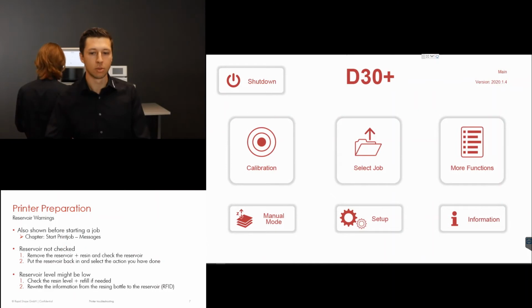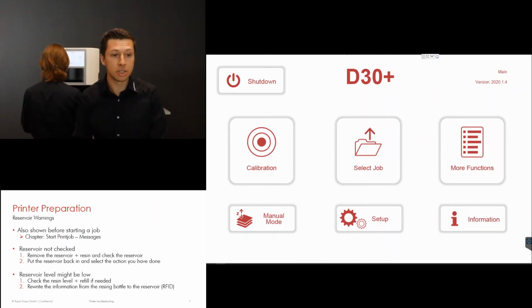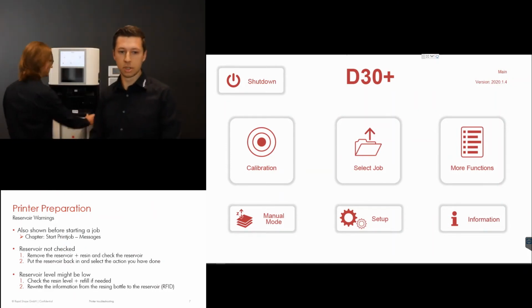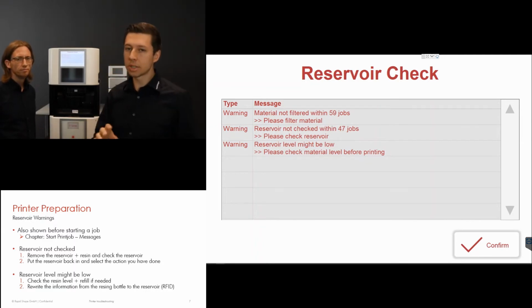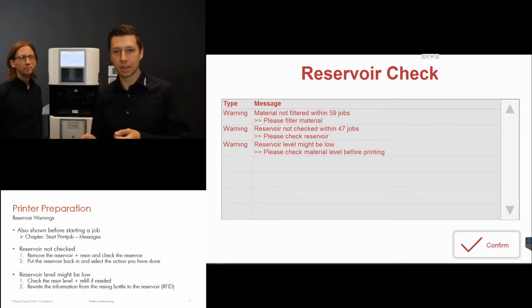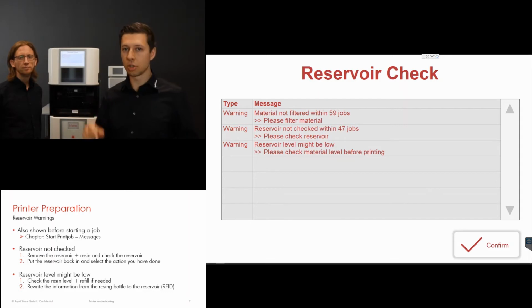So when I'm inserting a reservoir, there will be reservoir warnings. Robert is now inserting the reservoir, the machine is trying to discover it, and there it is, directly reservoir check. Ooh, there are some warnings. These warnings will also be shown before starting a job. For example, you can switch off the reservoir warnings in the settings.